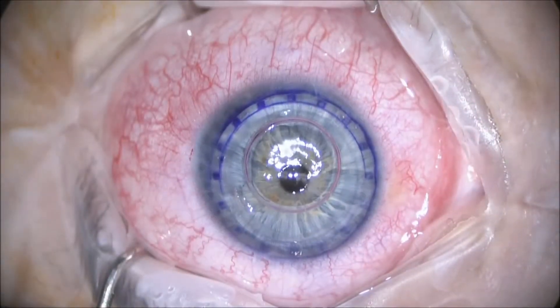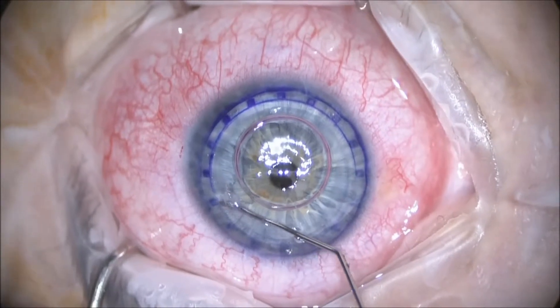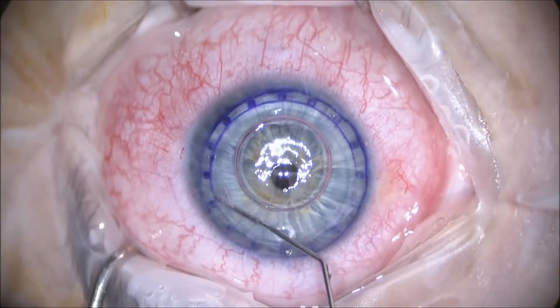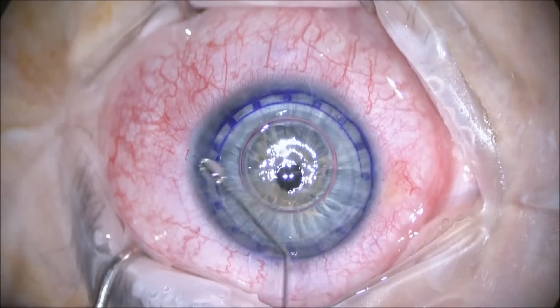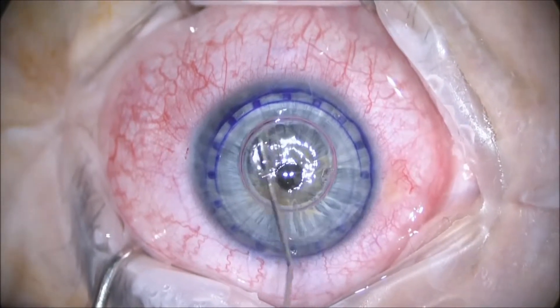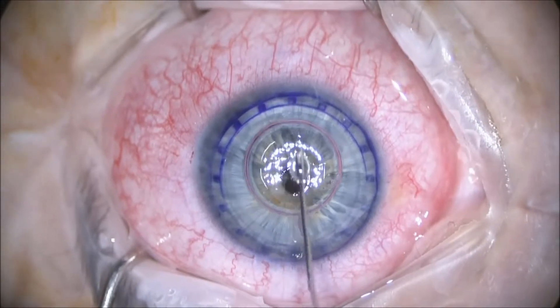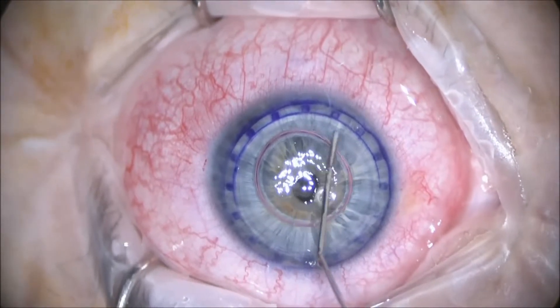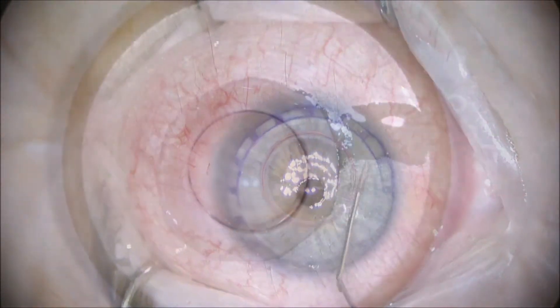So once that's all done, what you see here is bare Descemet's membrane and the removed overlying cornea. It's important to irrigate the cornea well to remove any viscoelastic prior to sewing in the donor graft.